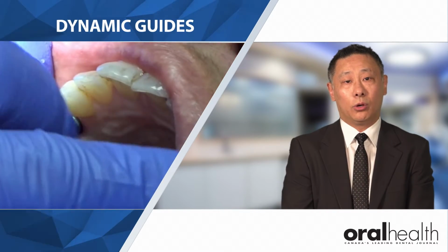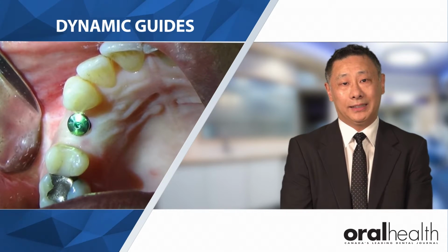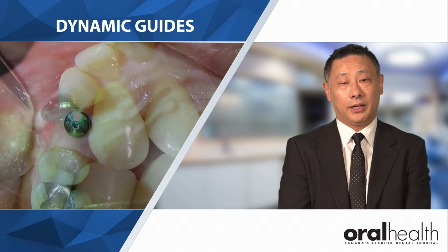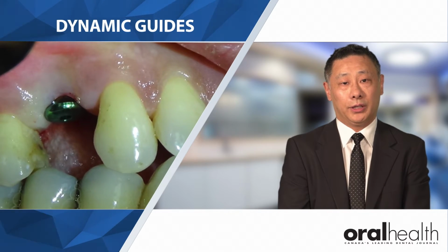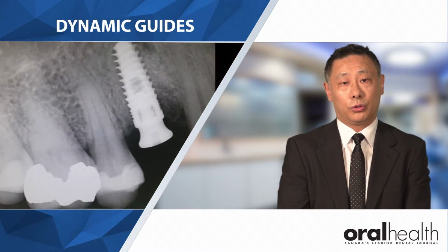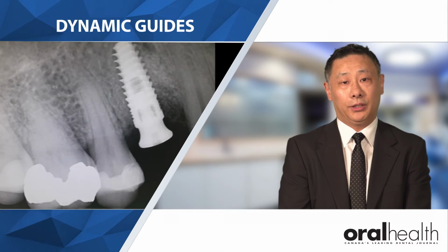Of course, the end goal of all three modalities is that we place the implant in the treatment plan position that's desired for the final prosthetic of the implant restoration at the end. And of course, to avoid any clinical or surgical complications and or anatomical limitations.